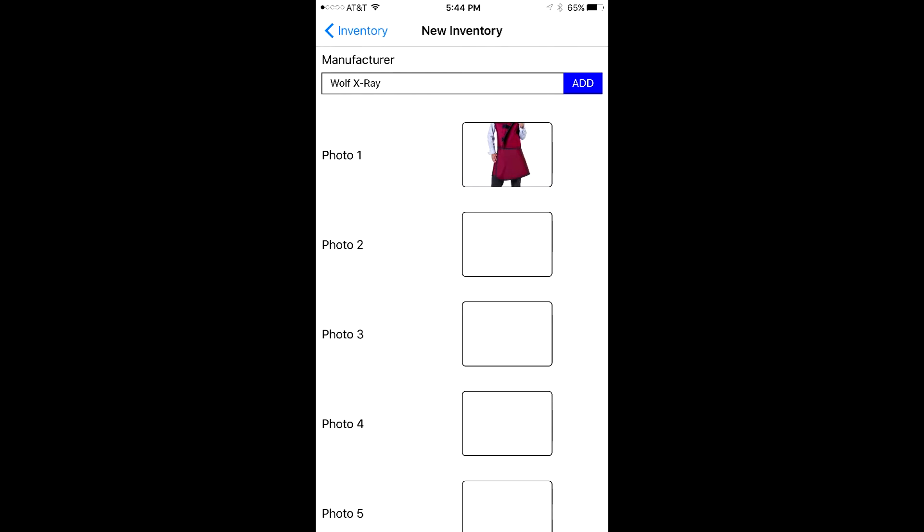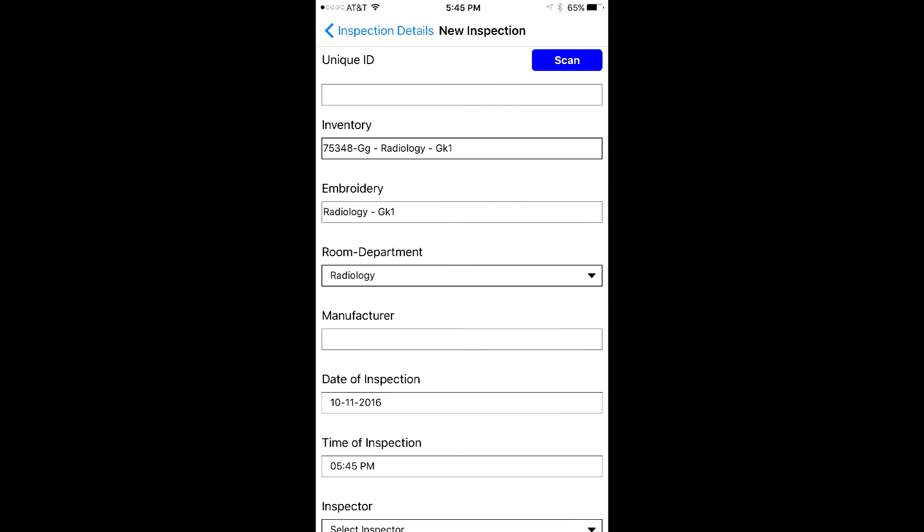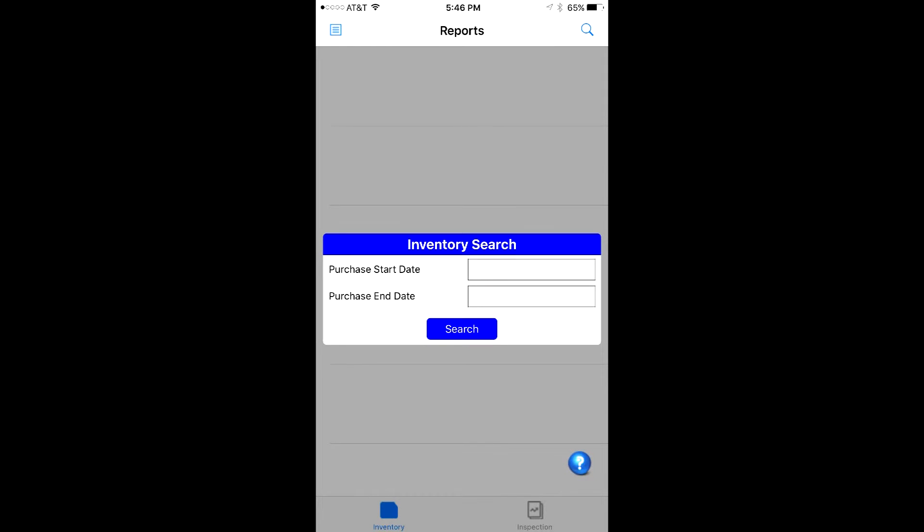When an inspector is ready to inspect an apron, he or she would navigate to the Inspections tab. The app will then notify you when to inspect again, so no need to worry about reminding yourself. The app will do it for you.